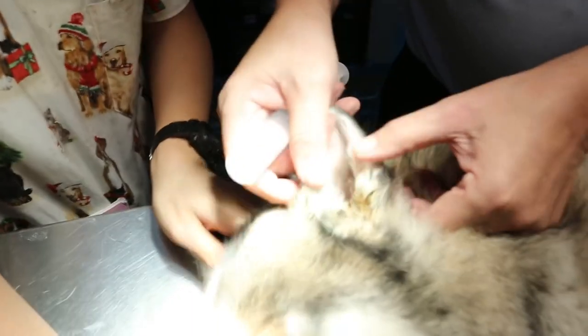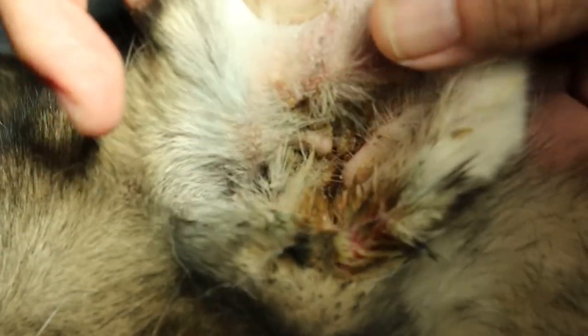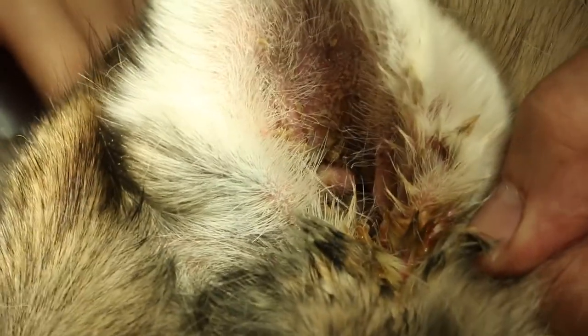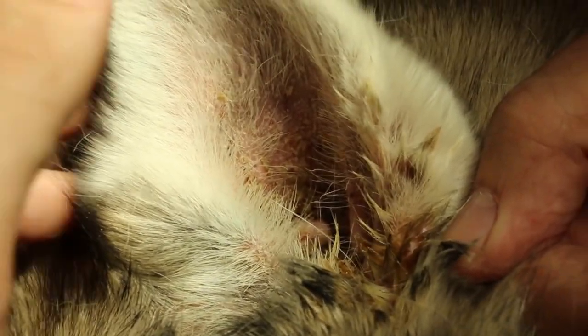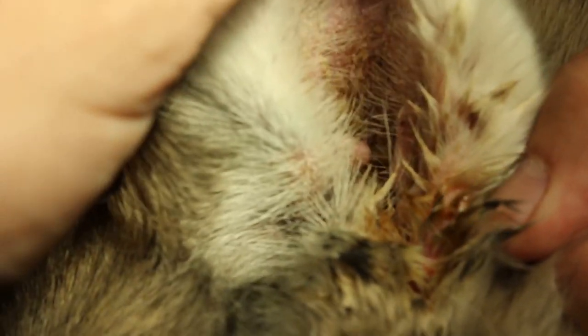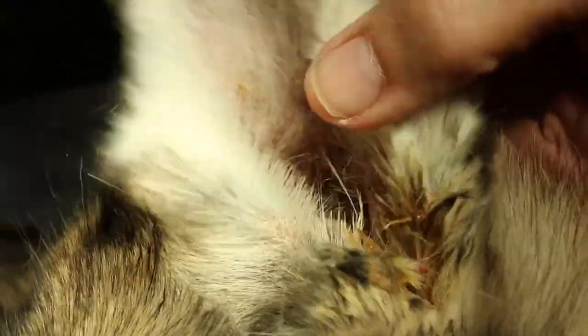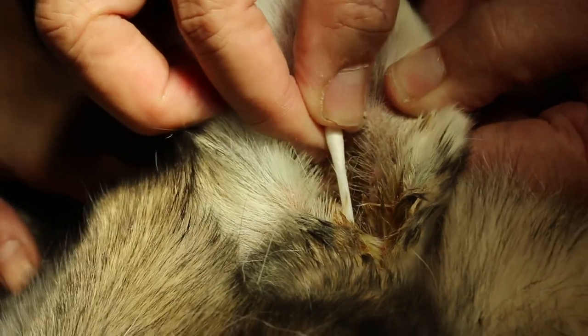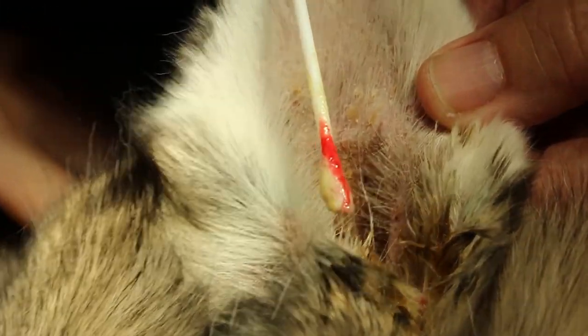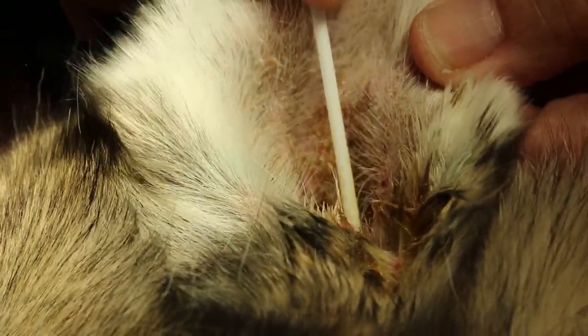You can see the ear is pretty bad. Since 5 years ago — the first time I did ear irrigation was 5 years ago — the owner has been treating it with occasional ear drops but it's got worse. You can see the ulcers and the pus. There is even blood there. This is really bad, that's why the owner comes. The right ear is similarly painful, but we're doing the left ear first.